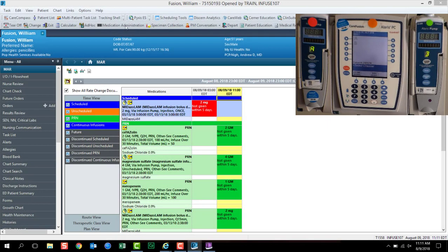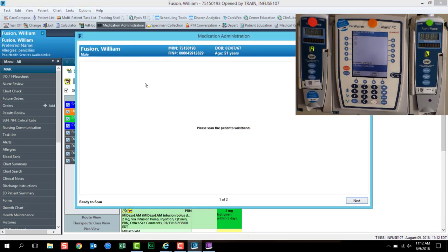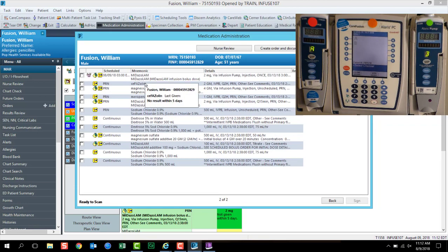We will begin with the primary continuous infusion workflow, the basic foundation for smart pump programming infusions. Click the medication administration button in the toolbar. Next, you are prompted to scan the patient's wristband barcode. Now we will scan the barcode for the infusion IV bag.